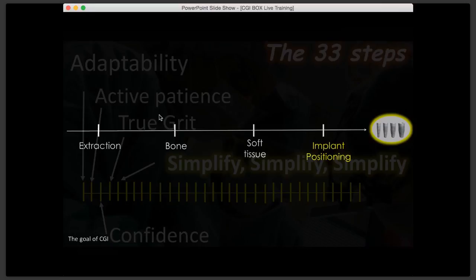Now, all you need to do is split the roots. And I'm going to use a straight carbide burr, split the root buccolingual all the way through. Don't be shy. Split it all the way through into the furcation bone. Try to preserve the furcation. So one way is to gauge the root trunk and see how wide it is, so you don't go in and wipe out the radicular bone, and then remove each root separately.